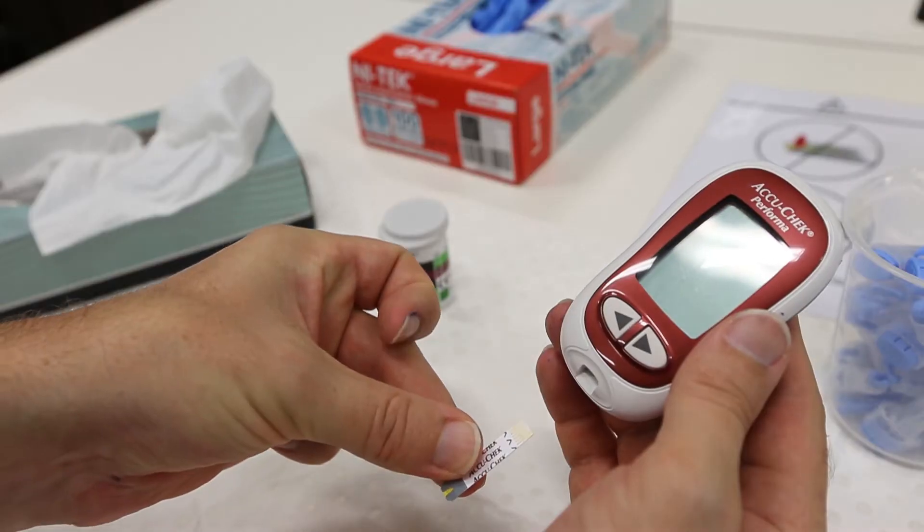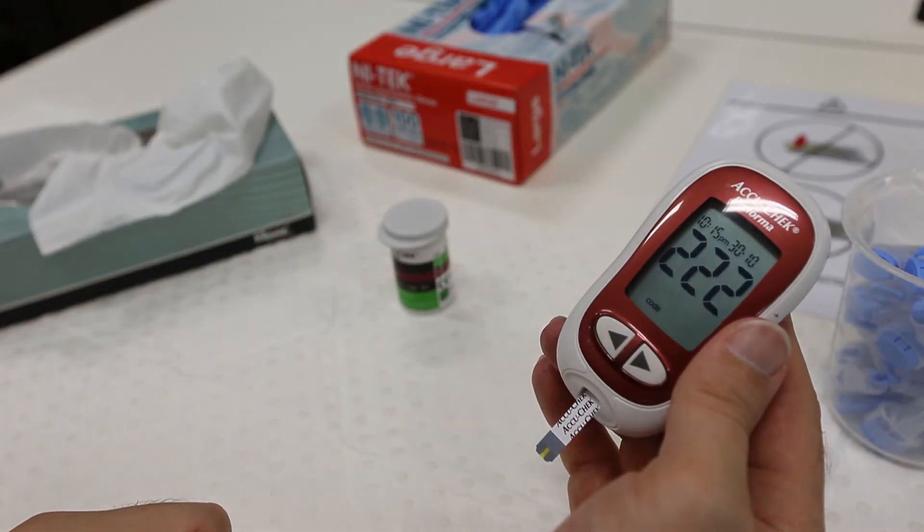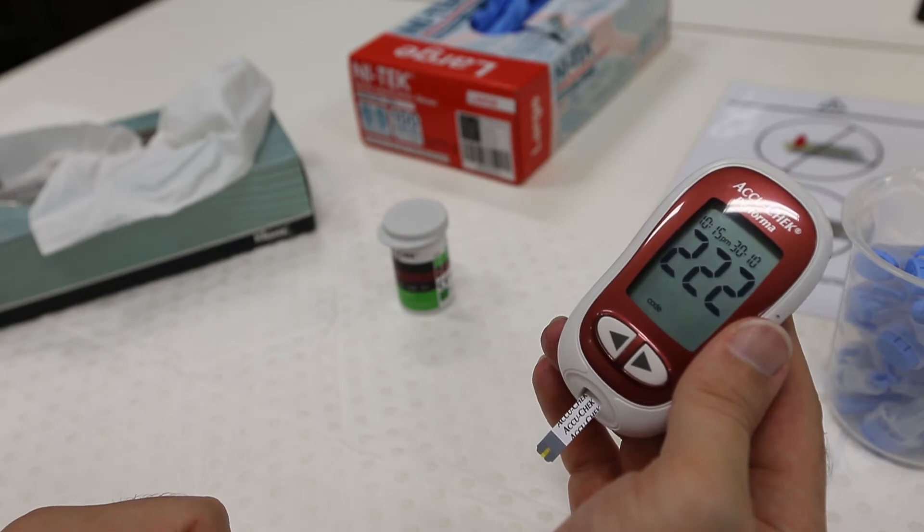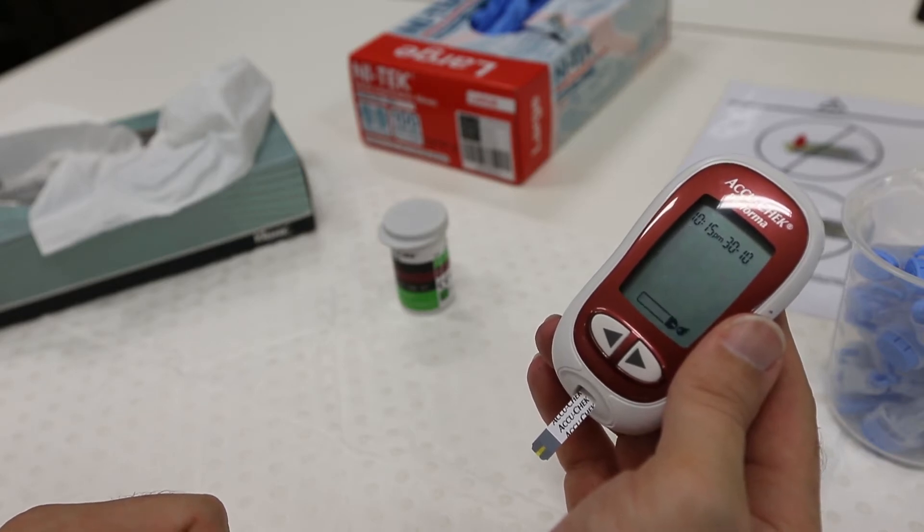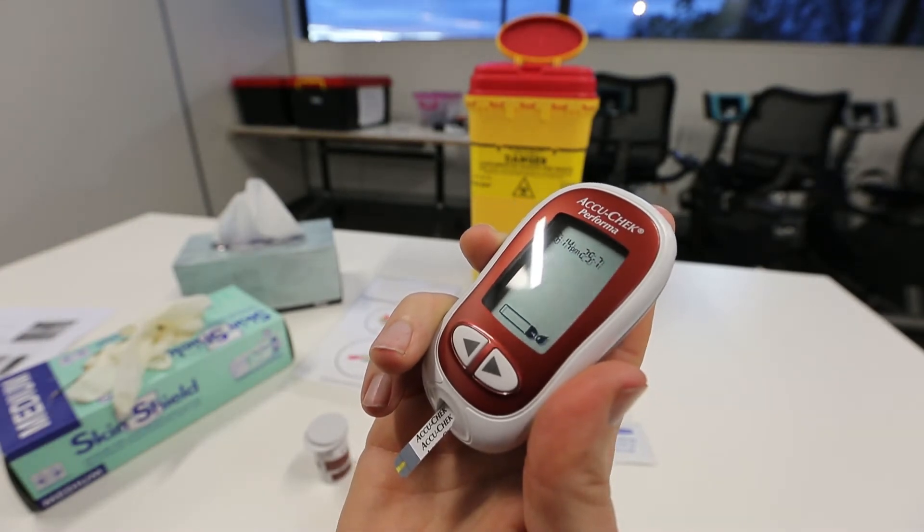To turn on the blood glucose meter, place the test strip with the copper electrodes facing up into the small slot at the base of the unit. The unit will now momentarily display a code before then displaying a symbol of a test strip with a small droplet of blood to indicate that the unit is now ready to collect blood.